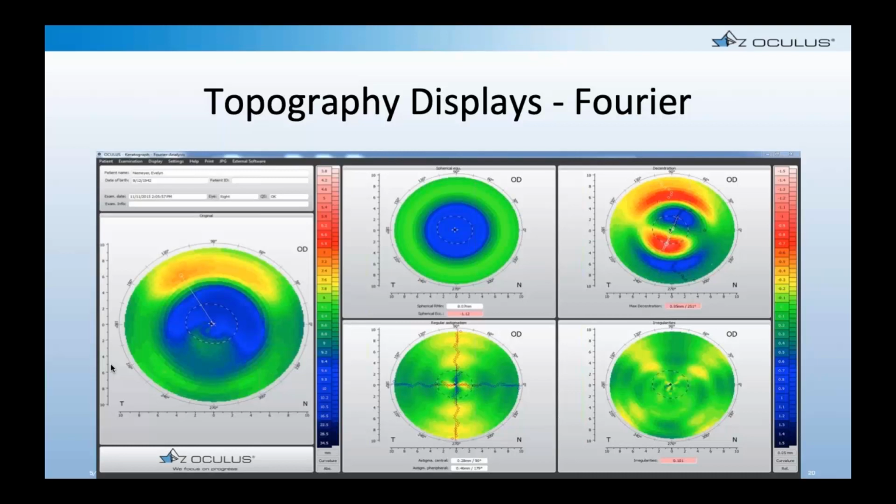They come in for a follow-up, and they're complaining their vision's not that great. They find their vision is 20/30 or 20/40, and you refract them, and you get a bit of minus power. And you look at the topography and think, well, that little spot of green that's extending up inferiorly doesn't look that significant. How significant really is this?